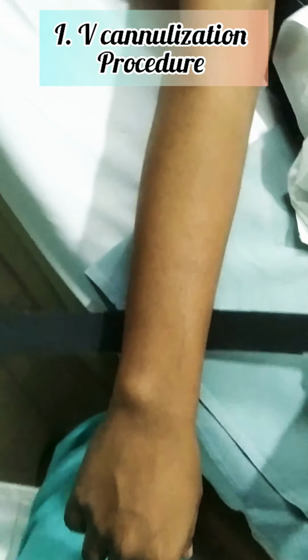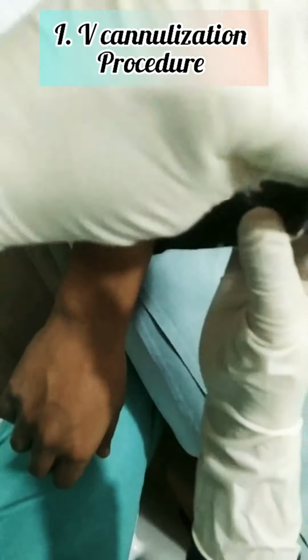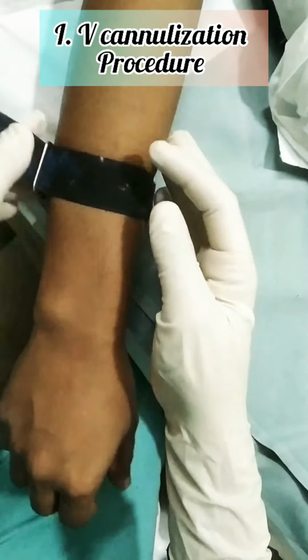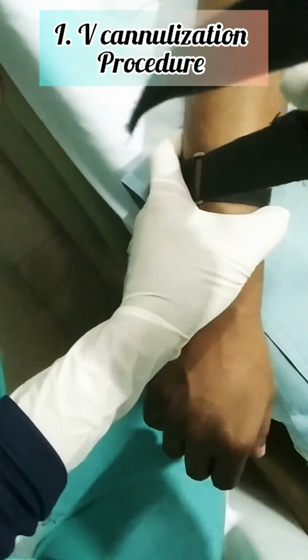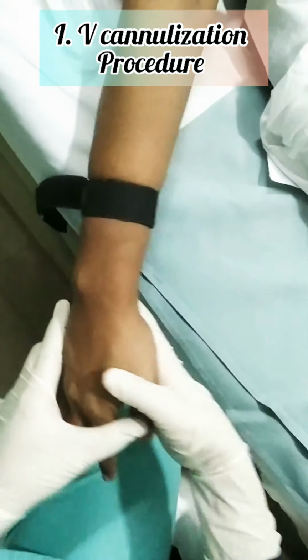Next are the steps of the IV cannulization. First of all, we have to wear gloves, and they should be sterile gloves, because it's an invasive procedure and we are going to do phlebotomy. And second, we have to prevent cross infection to the patient as well as to the caregiver, so we have to wear the sterile gloves.